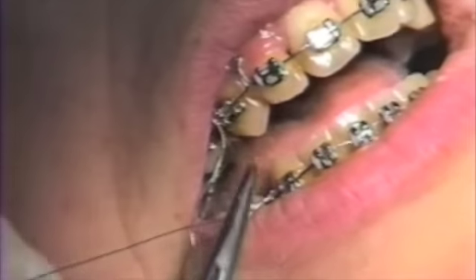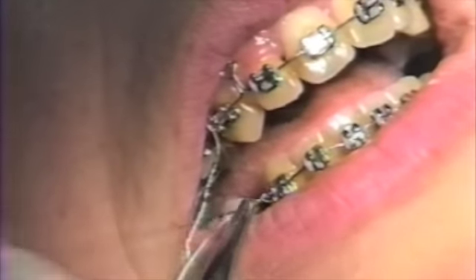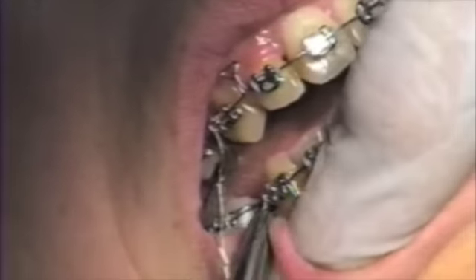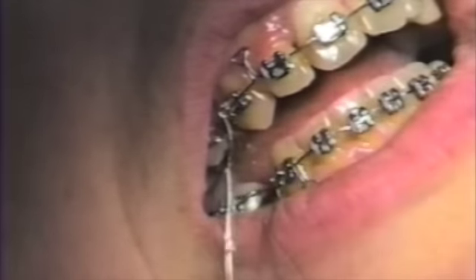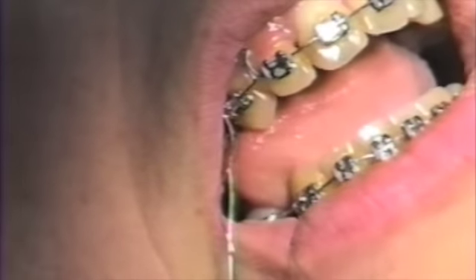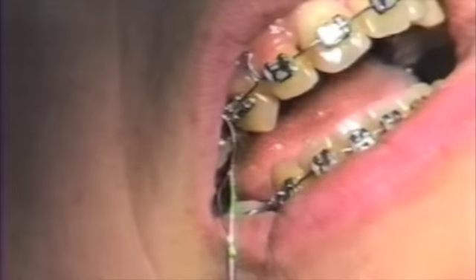Upper and lower cuspids both rotate distal lingually as well. It is not necessary to tie in the mesial tie wing since the mesial buccal rotation of that tooth is engaged in the wire naturally.